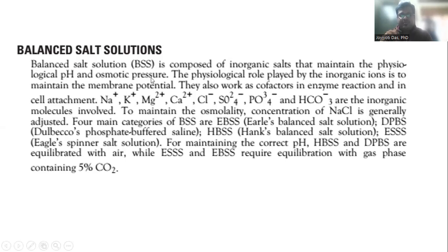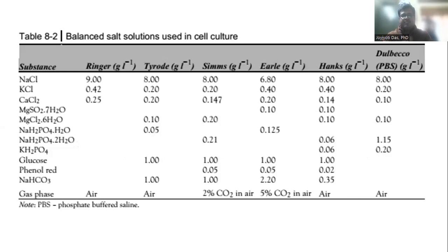So if you provide balanced salt solutions to your cells, they can survive and also grow in them, but not for long-term cultures. You have to supplement them with other constituents for long-term culture.